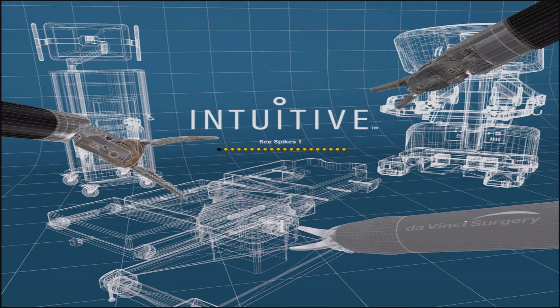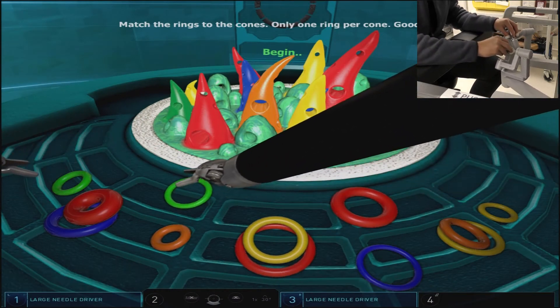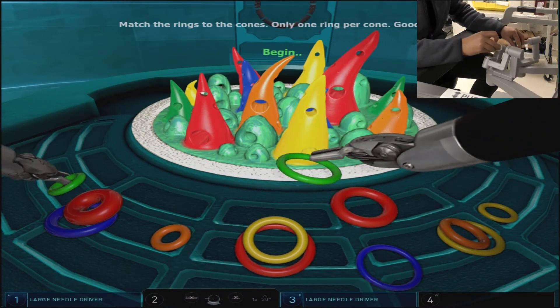Sea Spikes 1 is an exercise that requires the placement of rings around cones in coordination with their colors. Keeping a larger view of the field and using both arms simultaneously is optimal.